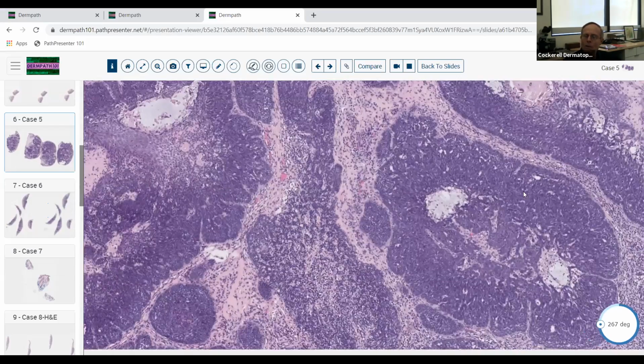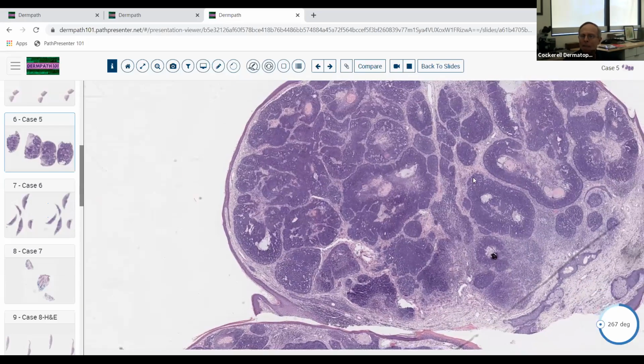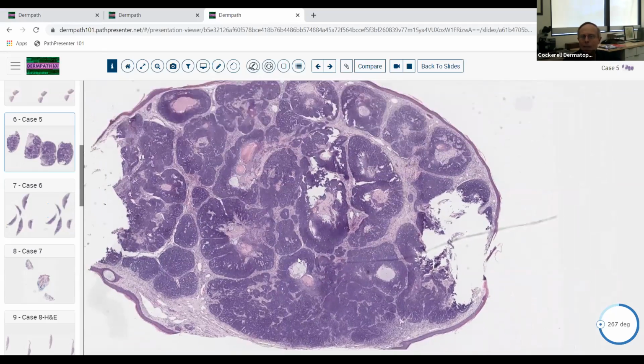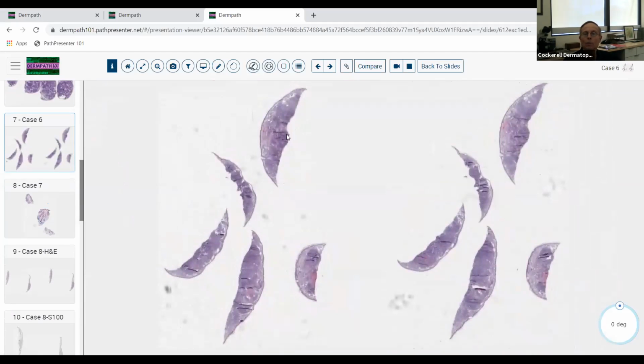So hopefully you all learned something from this. It's not a classic trichoepithelioma. Those usually have even more well-defined hair follicles and more papillary mesenchymal bodies. They don't usually have these large aggregations like this that are somewhat slightly asymmetrical. So this would not be a classic trichoepithelioma. We would call this more of a trichoblastoma, more primitive than a typical trichoepithelioma. Okay, so hopefully everybody got this.